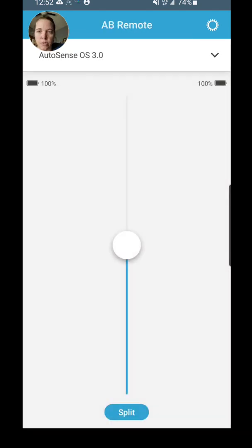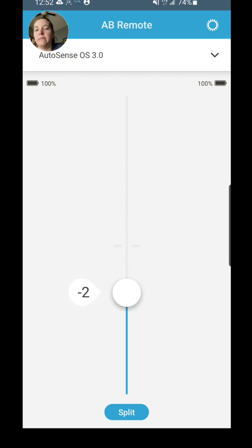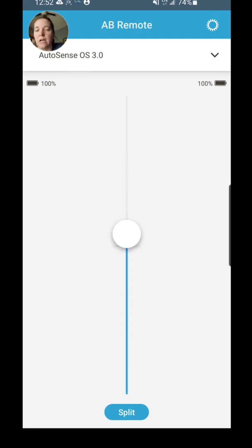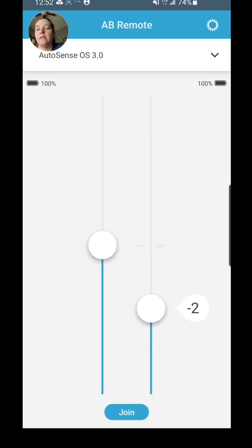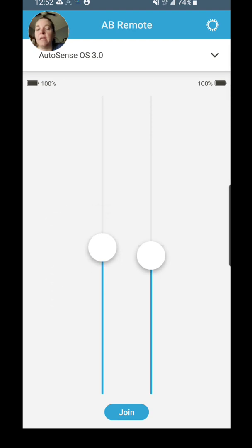It allows me to switch the programs really quickly and easily through the app. This is your volume slider here. Now it's going to adjust both of them at the same time, I can also split it though, so if I want to adjust my right ear or my left ear I can adjust that and I can put it back together.